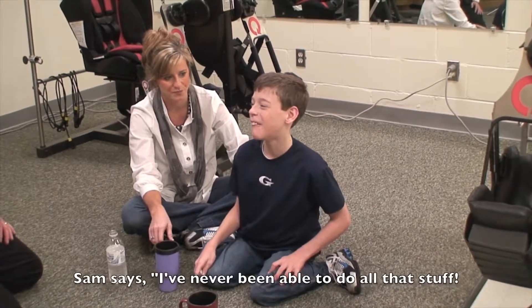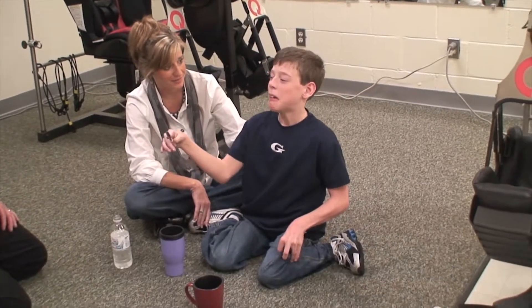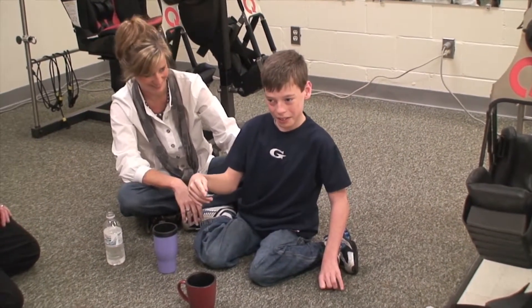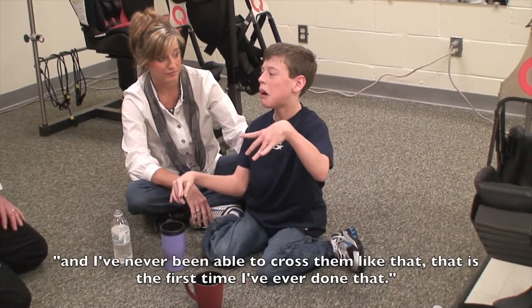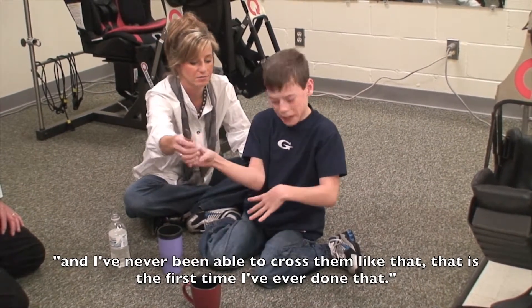I've never been able to do all that stuff. I've never been able to raise my hands up that high. It's an emotional thing. I've never been able to cross them like that. That's the first time I've ever done that.